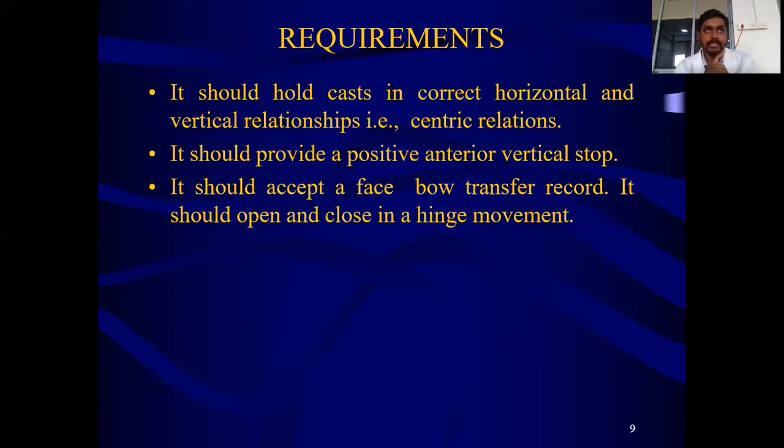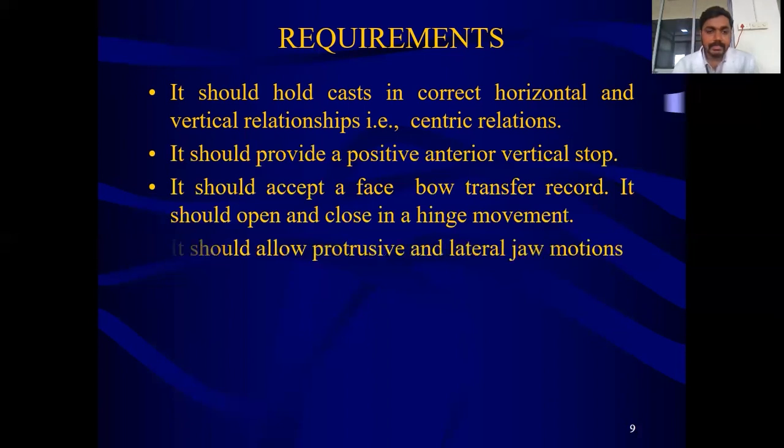So a facebow is a caliper-like device which is used to record the maxillary occlusal plane. After recording the maxillary occlusal plane and orienting the occlusal plane, only then will we be able to exactly record the opening and closing axis of the mandible. So what is a facebow transfer? That is a separate topic that we will be dealing with later.